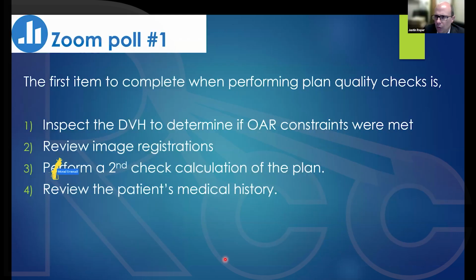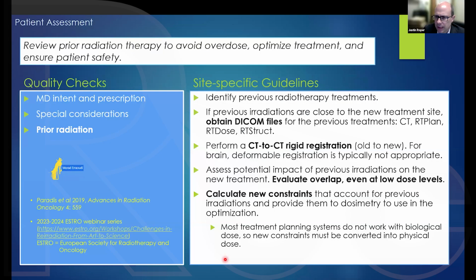Jose? Yes. We have a couple of questions in the chat. Let me read off the first one and I'll let you field it. That is, can we do stereotactic radiotherapy for brain cancer patients who took 30 gray in 10 fractions for the entire brain? So this is SRS after whole brain.